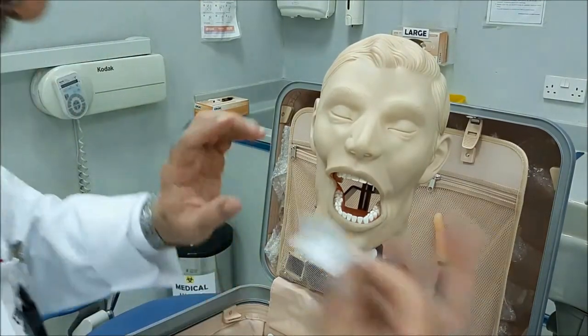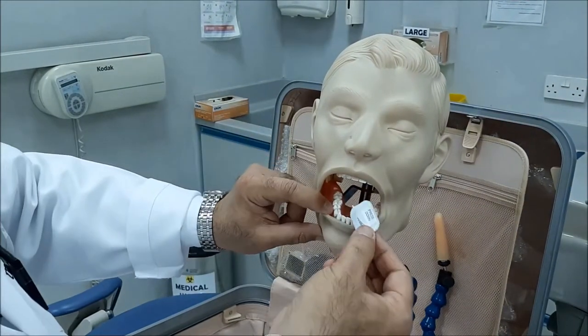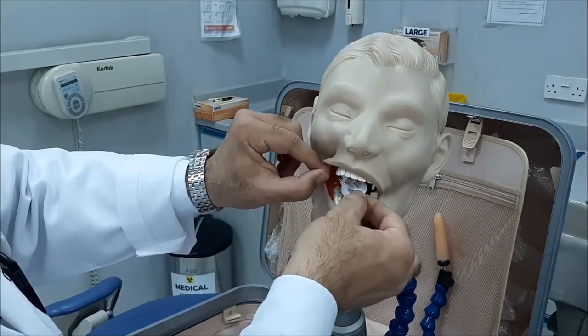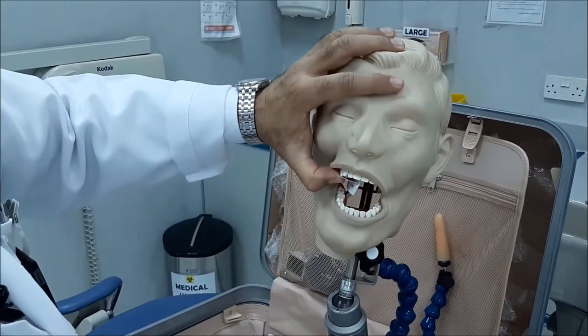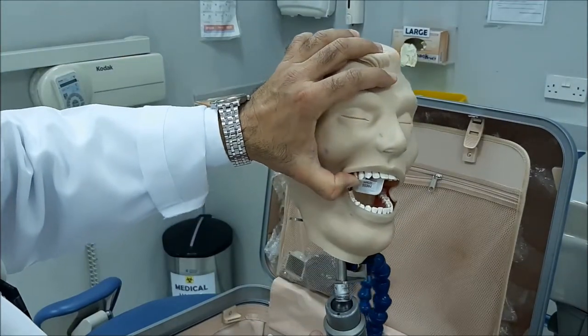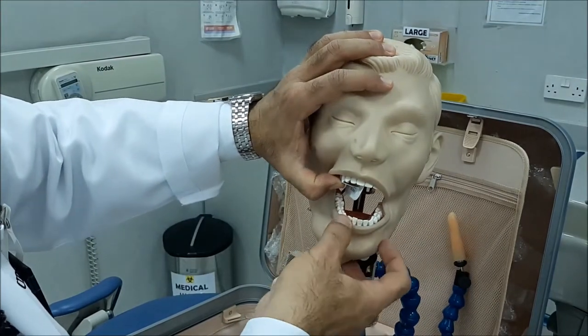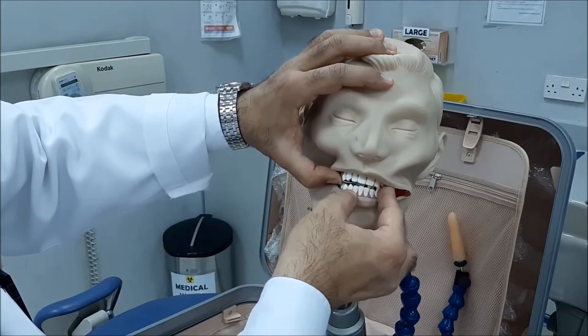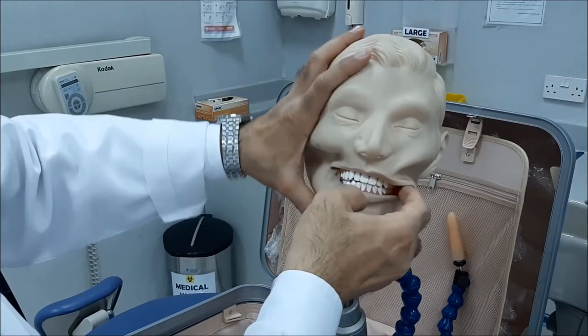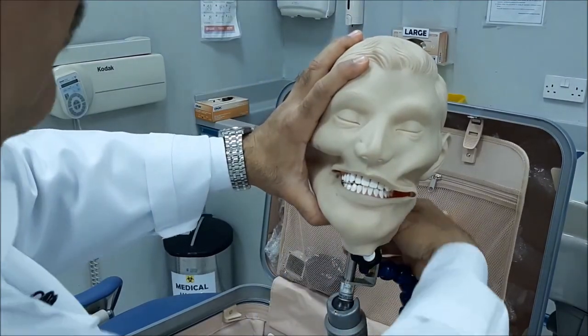I'll repeat again: one, two premolars on the center of the tab; two, see how it looks, and then ask your patient to bite. There is no interference, and then the patient is biting all the way down. Ask the patient to keep closing.